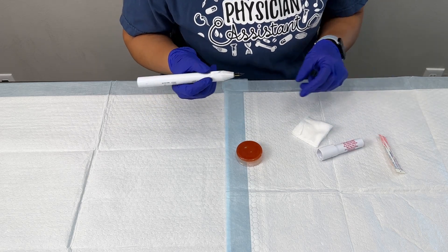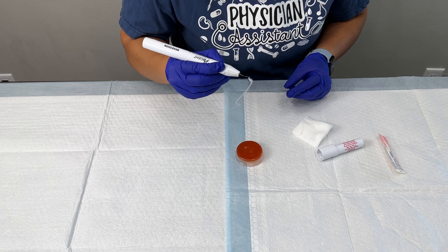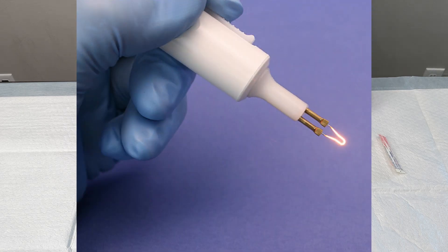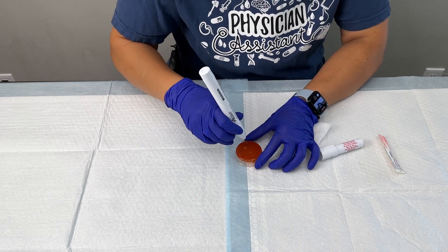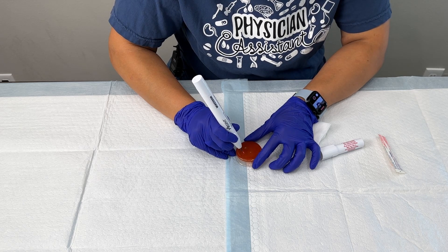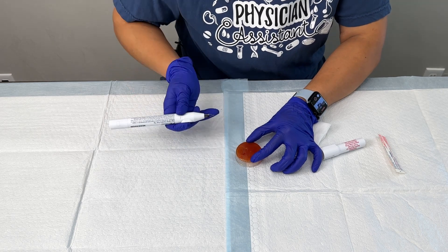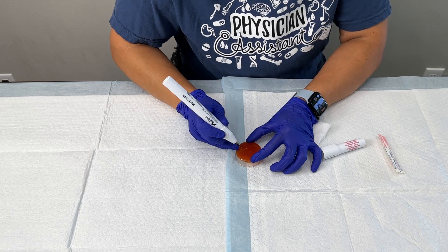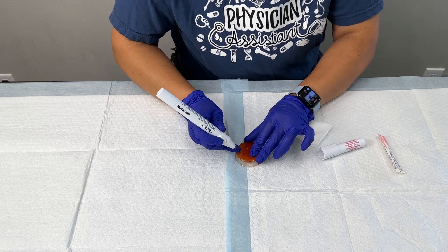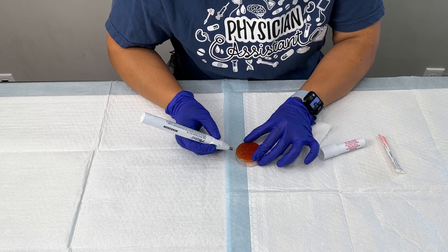I'm going to take the lid off my cautery pen. You'll see that this cautery pen has a little button to push. I'm going to prep it and make sure that it's working — I can see the cautery pen is flaming and the tip is turning red. That's how I know my cautery pen is working properly. I'm going to have the patient brace the toe, I'm going to brace myself as well. I'll turn on my cautery pen and touch the tip of the nail just gently. You'll hear a little sizzle, and once you go through that, you should see the drainage of some of the subungual hematoma. As soon as you go through that layer of nail, you will see the blood start coming out and that's when you stop. You can also kind of milk it a little bit. You don't want to go any deeper than that because then you'll touch the sensitive nail bed, which would be uncomfortable for your patient.